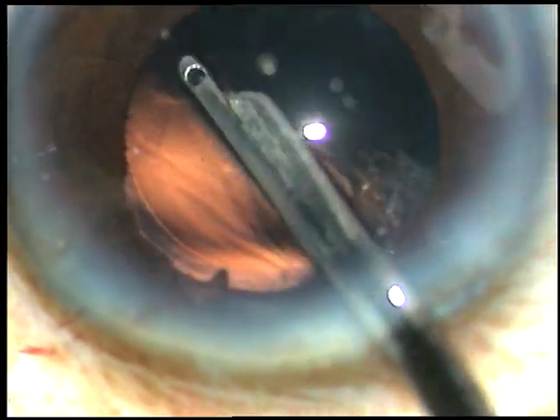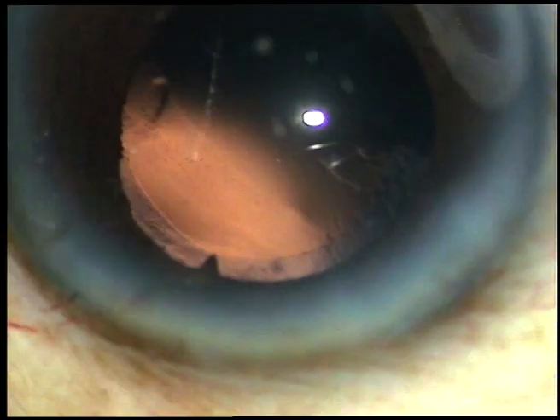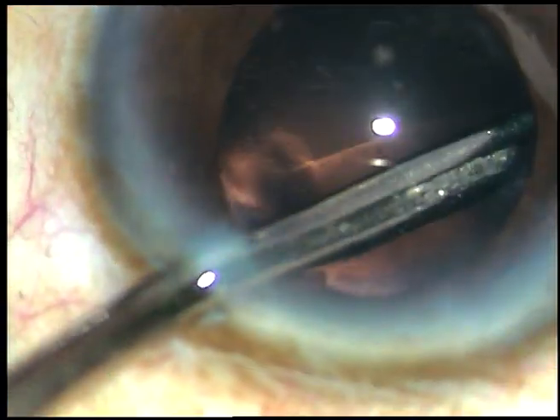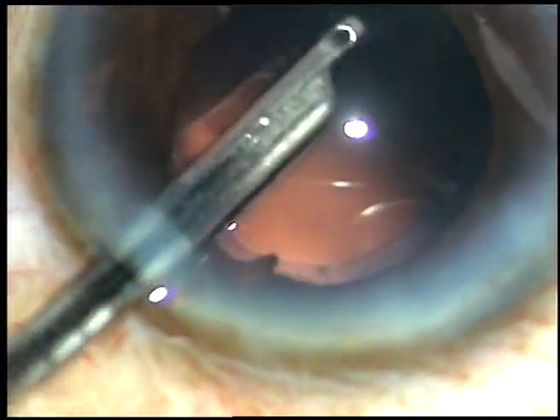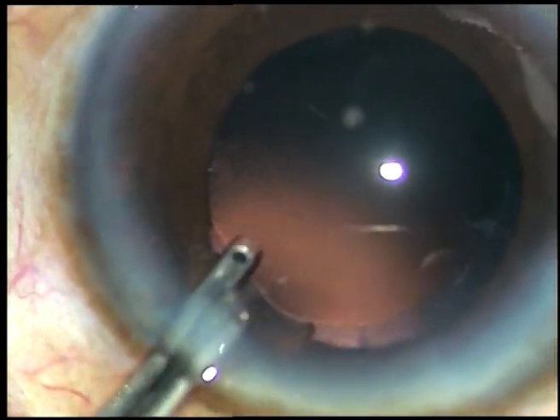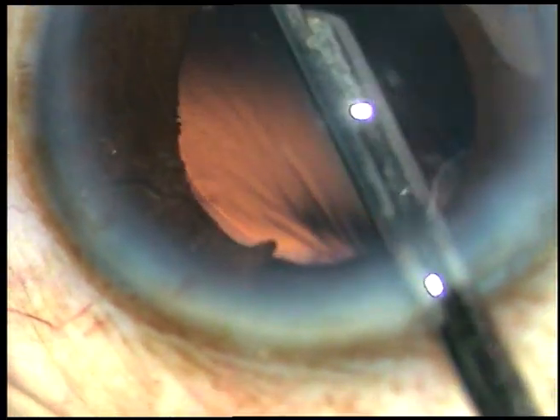Cortical cleanup is being done with the help of a 23-gauge Simcoe cannula. There is only one side port, and bimanual irrigation-aspiration cannot be used when you have made only one side port. The posterior capsule is very clean.